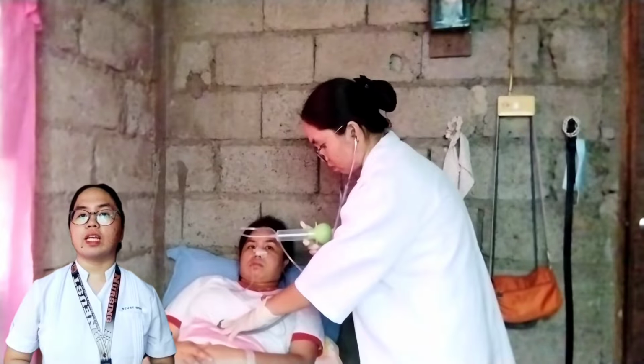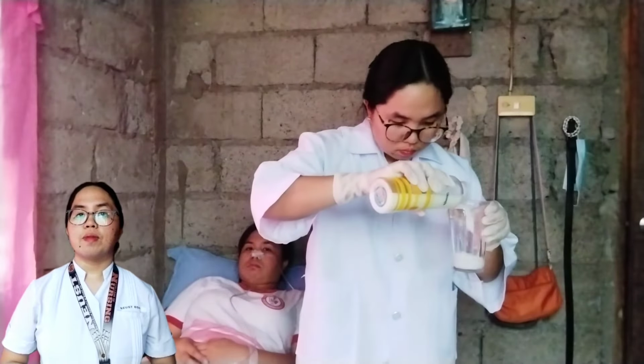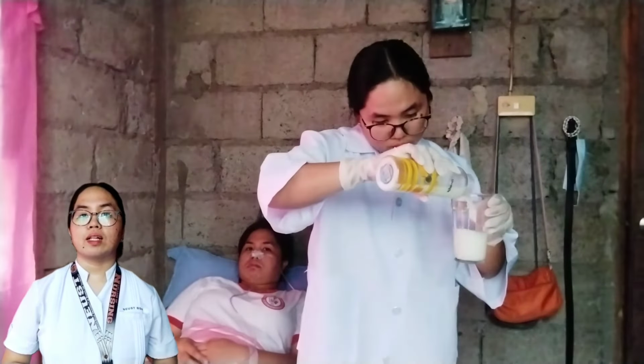Assess residual feeding contents. If the tube is placed in the stomach, aspirate all contents and measure the amount before administering the feeding. Administer the feeding. Before administering feeding, check the expiration date of the feeding. Warm the feeding to room temperature. Rationale, an excessively cold feeding may cause abdominal cramps.